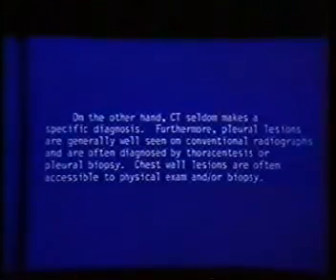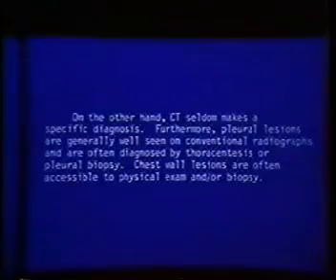But I think a totally separate issue that we really don't deal with often enough is, does this help us a lot? I think CT is not often making specific diagnoses of diseases of the chest wall and pleura, and many of these abnormalities are either easily seen on conventional radiographs, typically with pleural abnormalities, and then easily aspirated or biopsied, or alternatively even palpable, because chest wall lesions are often very accessible to physical examination.